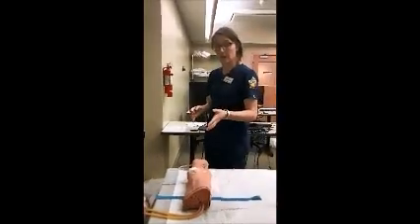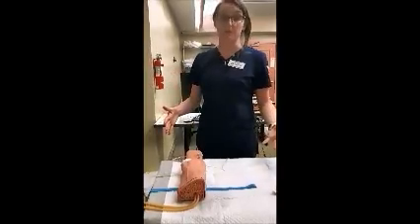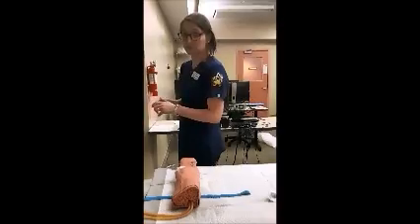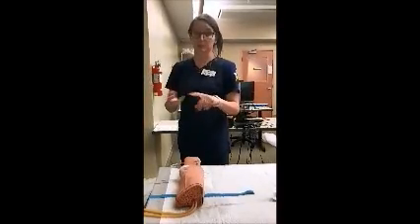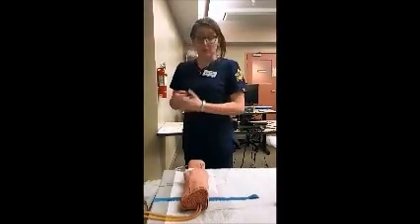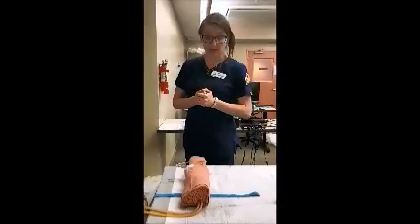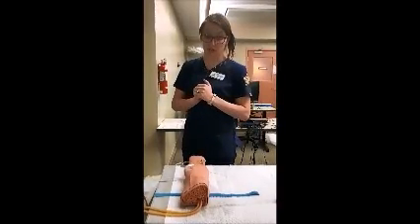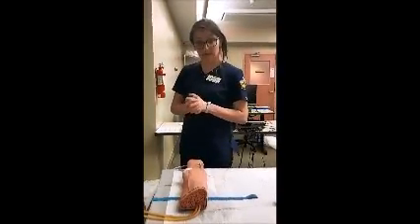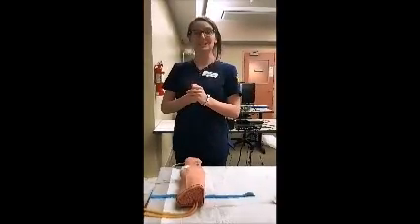So then I'll go ahead and lower the patient back to normal level if I moved him at all. Make sure his side rails are up, patient safety, patient privacy, perform hand hygiene. And I'm going to document as well that I was in to check it, that the drop rate was consistent, that the flow rate was correct, that the IV bag and tubing, that everything, there's no particulates, no cracking, no color changing, no air in the line, that the IV site had great integrity, no infiltration, no redness, no swelling, no bleeding, no phlebitis signs, and then we will document all that in the computer, and we'll be back to see Joe in an hour.